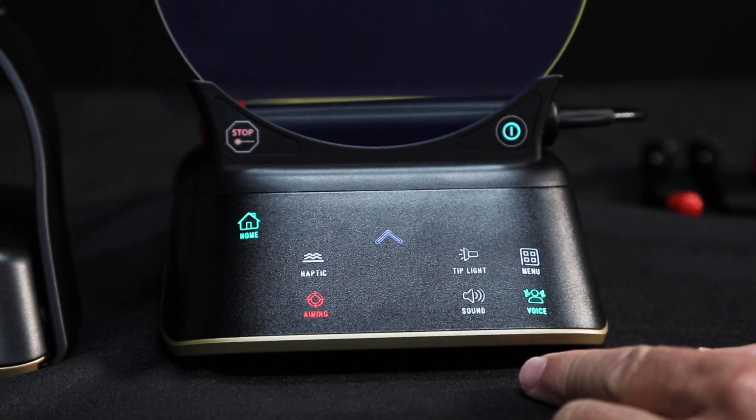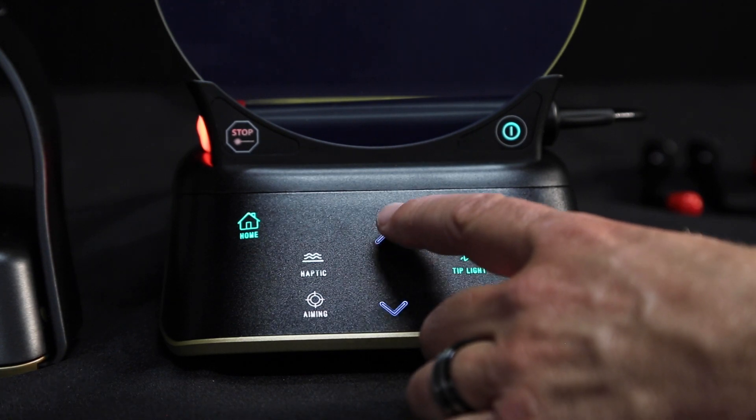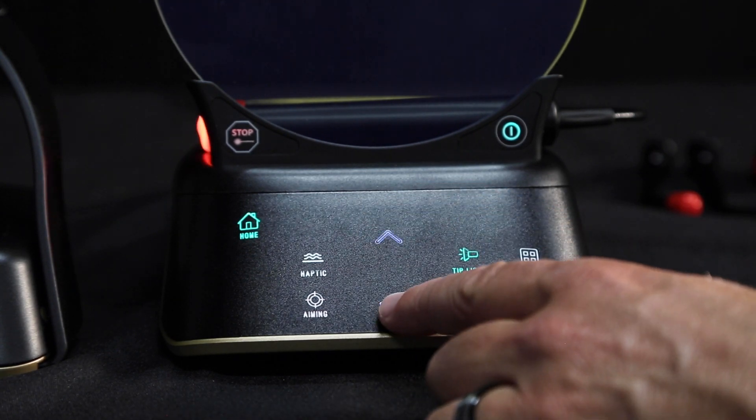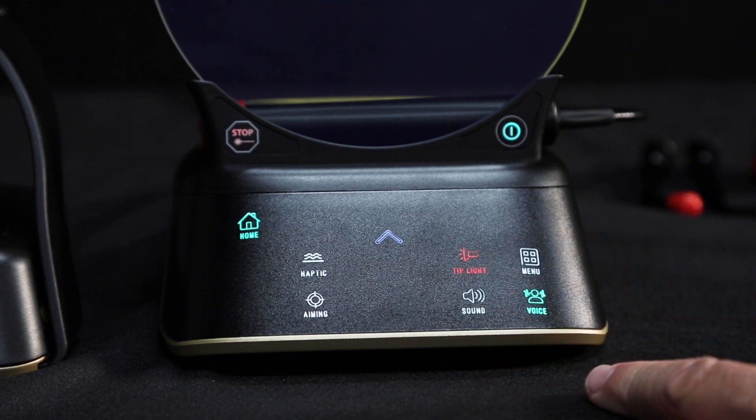The Gemini Evo handpiece is equipped with a tip illumination light to provide better visibility of the surgical site during treatment. Its intensity can also be adjusted between low, medium, high, and off.